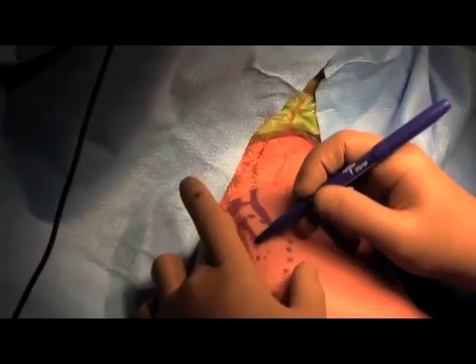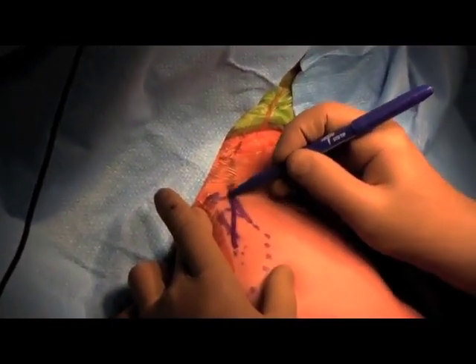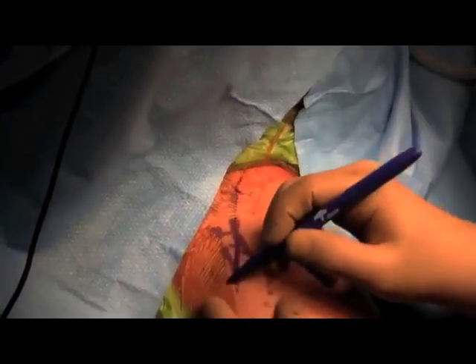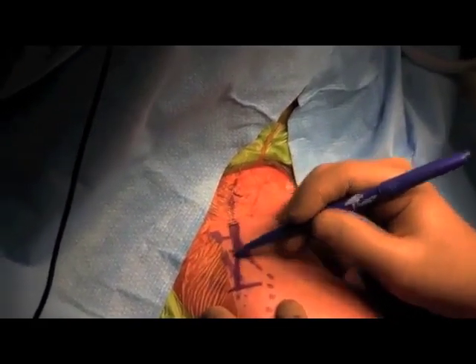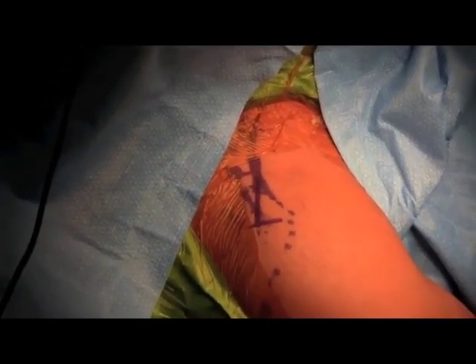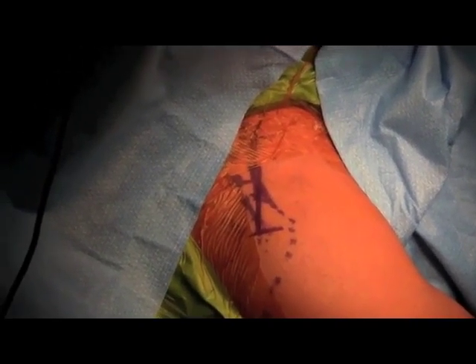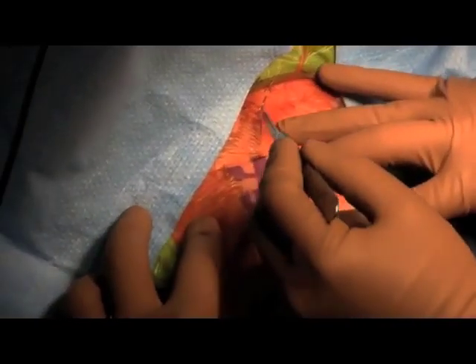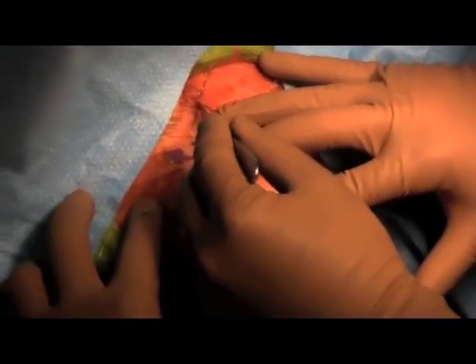The clavicle and associated landmarks are palpated. The incision line follows the length of the clavicle and is centered over the fracture site. The skin is incised down to the platysma muscle. The supraclavicular nerves may be preserved if identified.